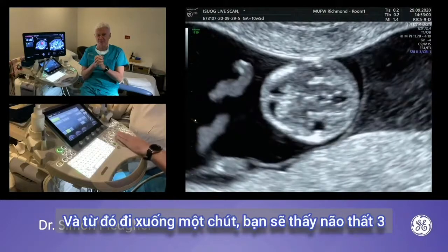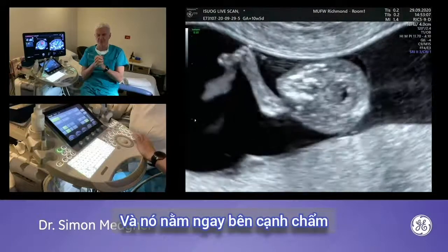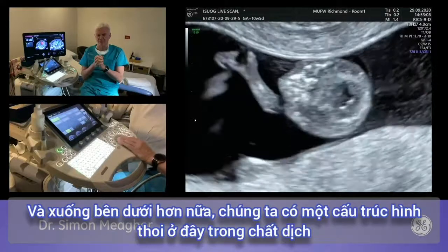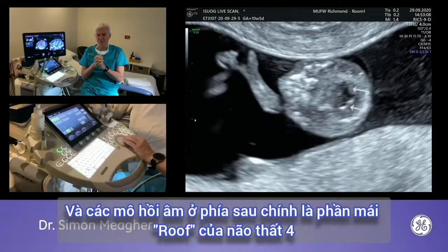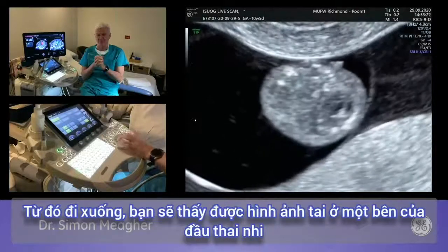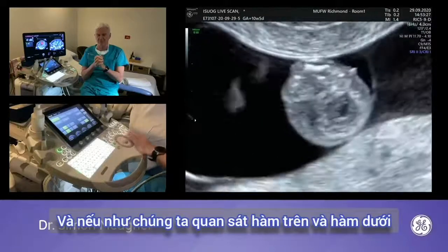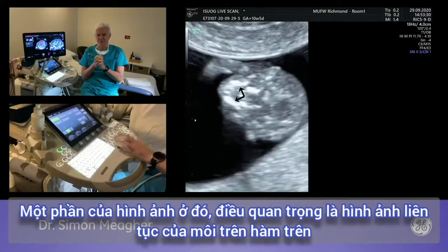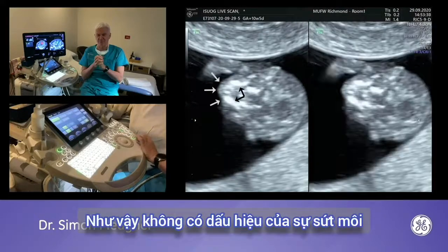The aqueduct is quite striking at this stage and sits right beside the occiput. Further down, there is a rhomboid-shaped fluid-filled structure — the fluid of the fourth ventricle — with the echogenic tissue posterior to it being the roof of the fourth ventricle. Coming down, you can see the ears on the side of the fetal head. Splitting the image, we can demonstrate the maxilla — the lip is continuous across it, showing no sign of facial clefting — and then the mandibular rami with the gap between them.